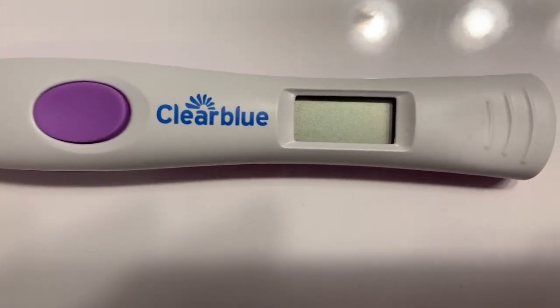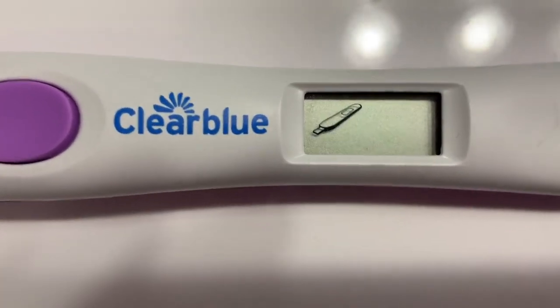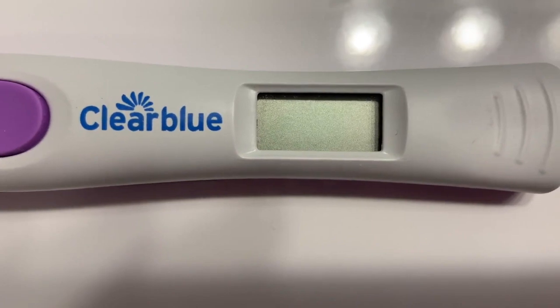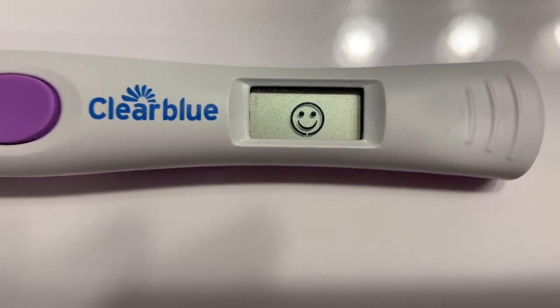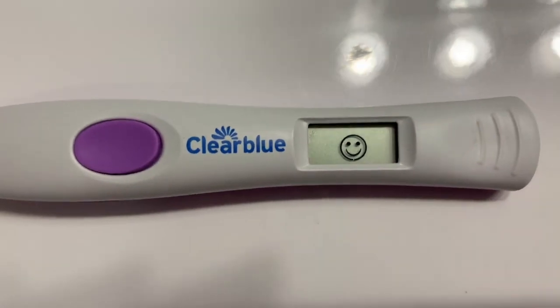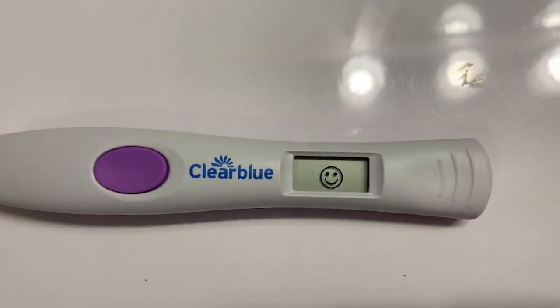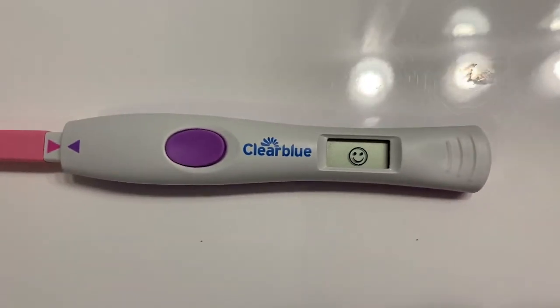Okay, it is still cycle day 11, February 15th, and it is 10 minutes to 8 p.m. I just wanted to see if maybe I'm going to get a flashing smiley face. Oh my gosh. Oh my gosh. What? Okay. Oh, geez. I did not expect this. Okay, so as you can see, I skipped flashing altogether.